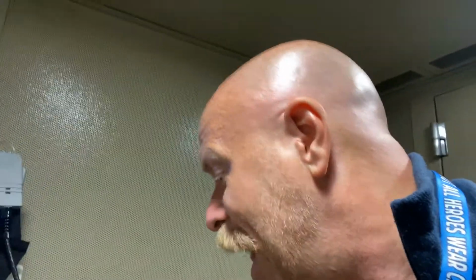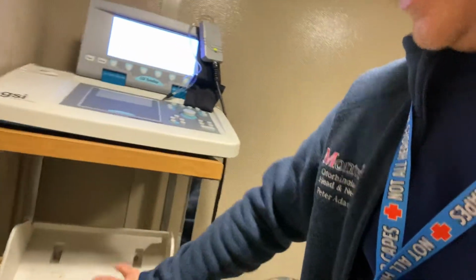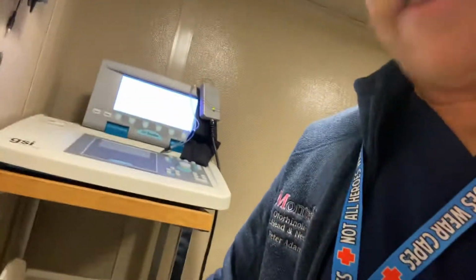Last but not least we have is what's called play audiometry. Play audiometry basically involves a portable audiometer, which I'm going to show you right here. These old gals are very old, but they still work. You know a school audiologist when you see them carry around one of these things like it's their little accessory. If they have an audiologist action figure, their accessory is this portable audiometer. Now, with play audiometry, I've got the portable audiometer here.